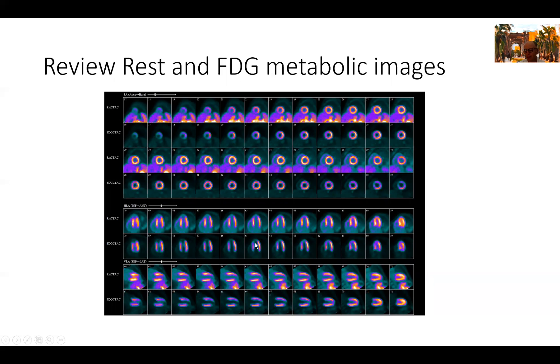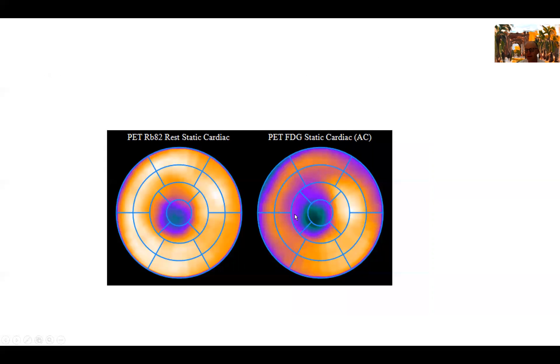Had we been dealing with a situation of hibernation, you would see a mismatched defect where you have a defect in the apex picking up FDG in the metabolic images. This is not the case here. This is scar myocardium. You can see a perfectly matched defect in the apex. You can see it here displayed on the 17-segment model.